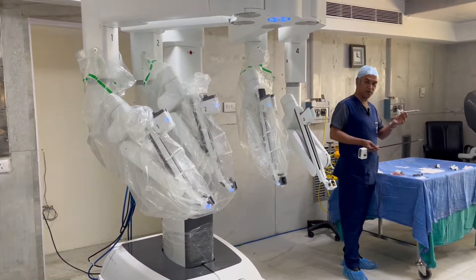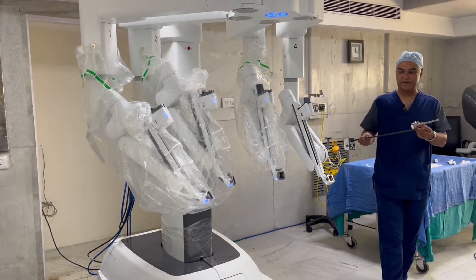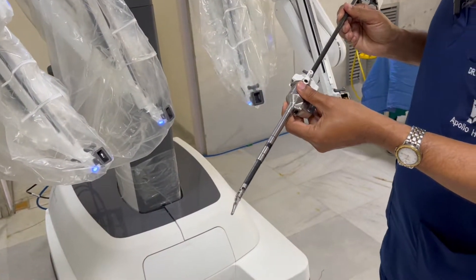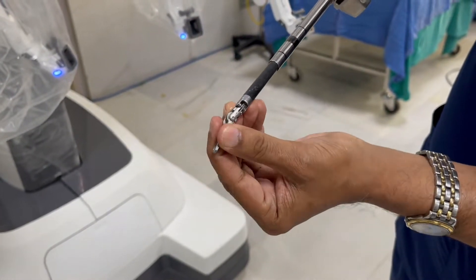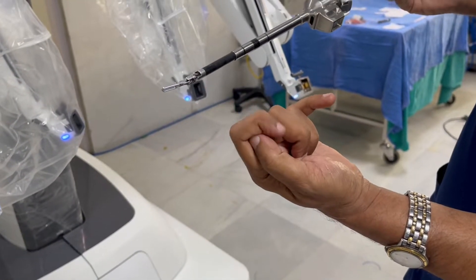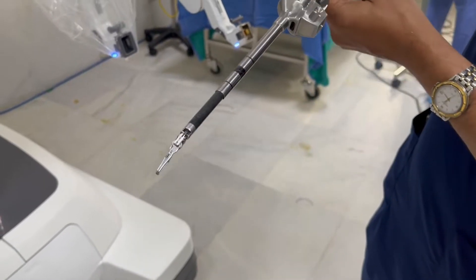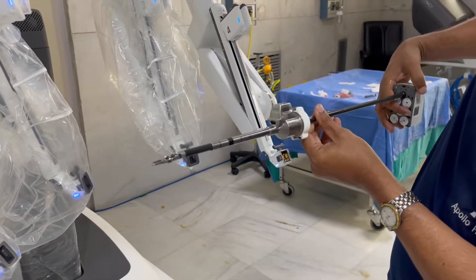This is a typical 8mm trocar of the robot and this is a typical instrument. I will show you how this gets connected. Into this trocar, this instrument goes in like any laparoscopic instrument. But what is interesting here is that this moves in 360 degrees — it moves all around. My human finger can only move in one direction. This is an extremely important advantage of these robotic fingers, whereby they can move in various angles.